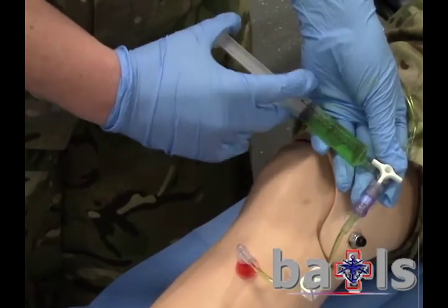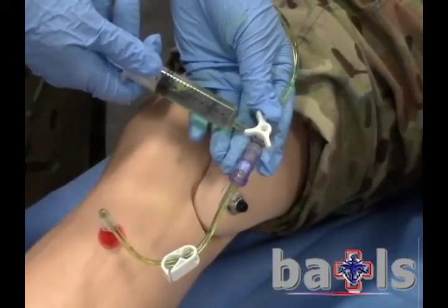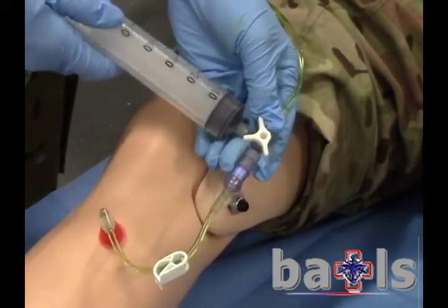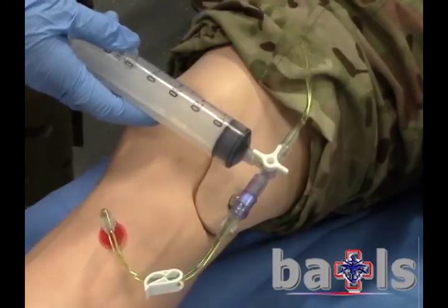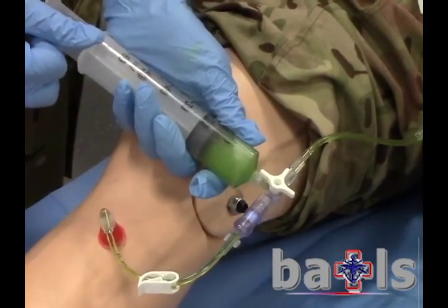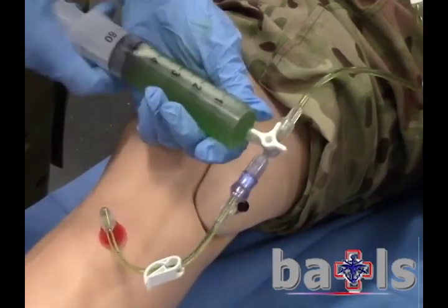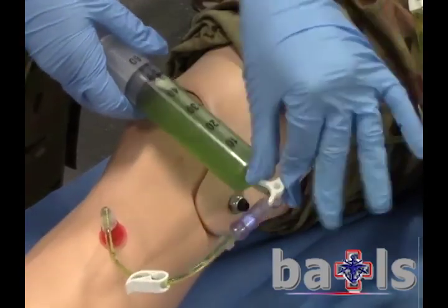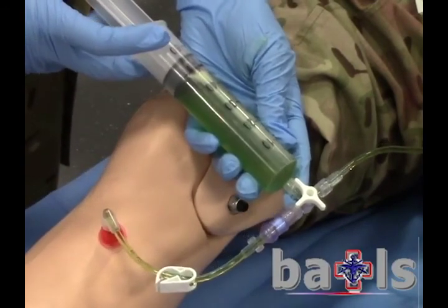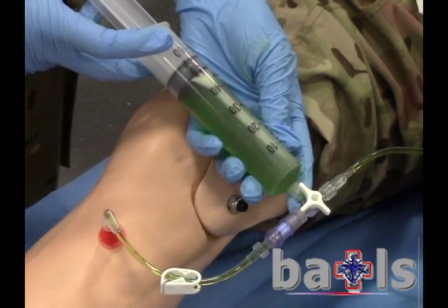Flush with 10ml of fluid to cavitate the bone. Close the extension clip and replace the empty 10ml syringe with a fresh 50ml syringe. Open the system to the bag and to the syringe and draw up 50ml. Open the system to the patient and to the syringe, unlock the extension tube and push through 50ml of fluid. Repeat a further four times to achieve a 250ml bolus.